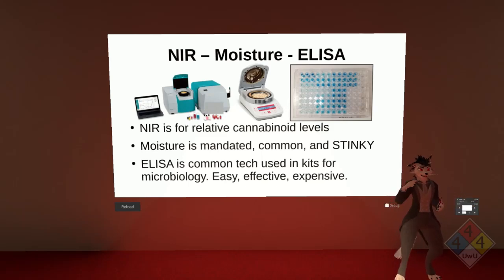So in some ways it brings down the cost a lot, and they're really not that hard to use as long as you can pipette consistently and accurately. But the kits are more expensive. These guys are a business. They need to make sure that they're making their money, right?